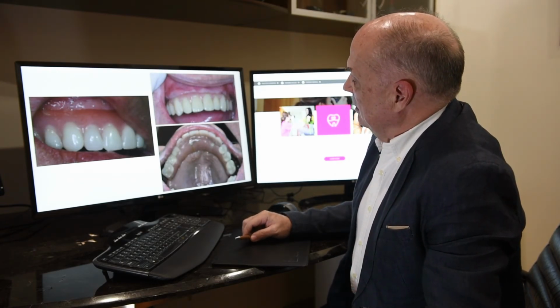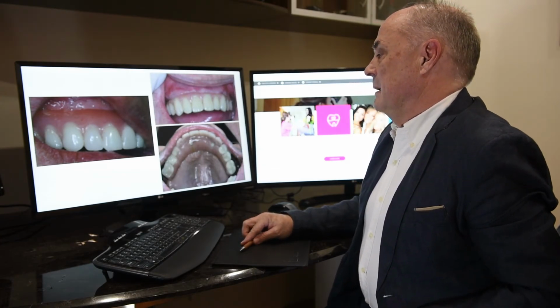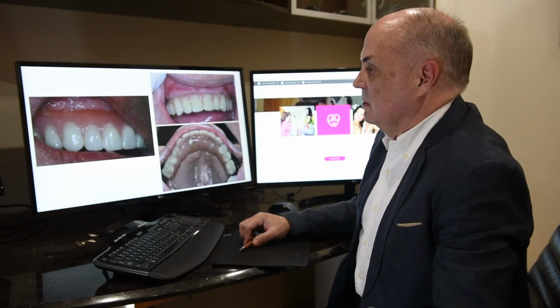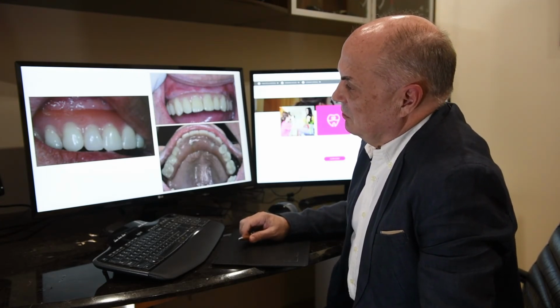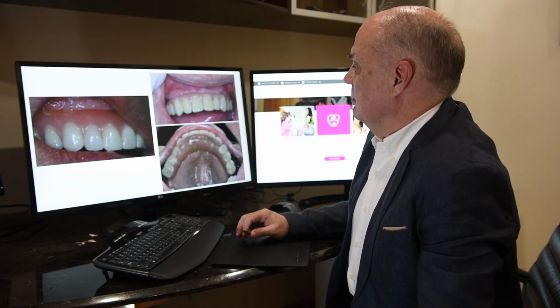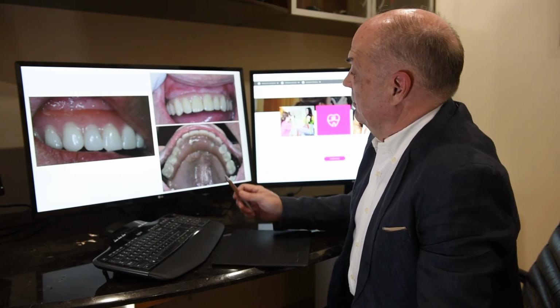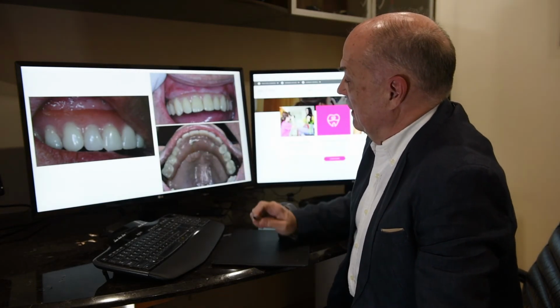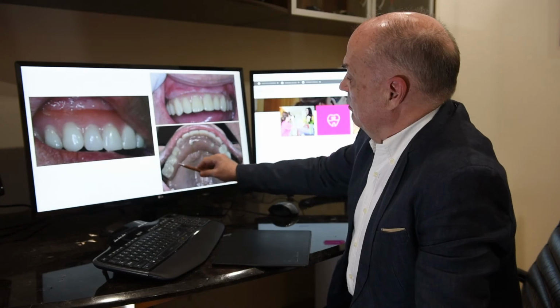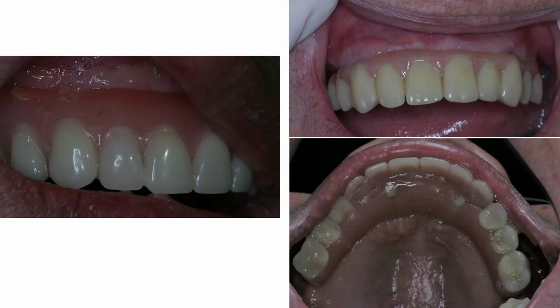When we got into the maxilla, that was a little bit more revolutionary when he redesigned the implant and came up with his own implant design and walked away from the standard parallel-walled old machine style of implant. So yeah, there was some clever design work, but it's not revolutionary. It's just a bolted down implant bridge. Some implants and some denture teeth bolted down. There is a newer version out which has got ceramic, zirconia, and they're a prettier looking alternative and a better finish, but it's still the same thing. It's just a bolted down bridge.